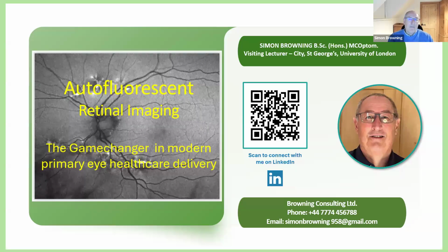We're going to be looking at some retinal conditions in an autofluorescent mode, but we'll be looking far more at those in the future as we go. So you'll see the title tonight is Autofluorescent Retinal Imaging, the Game Changer in Modern Primary Eye Healthcare Delivery. And that's really what it was to me.